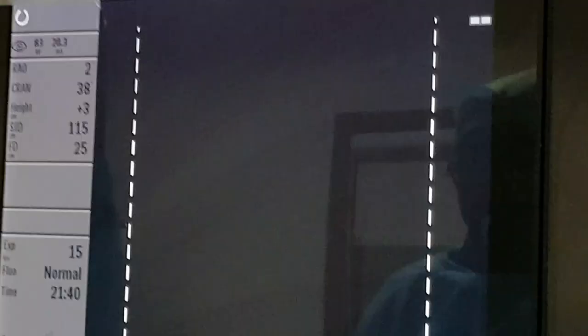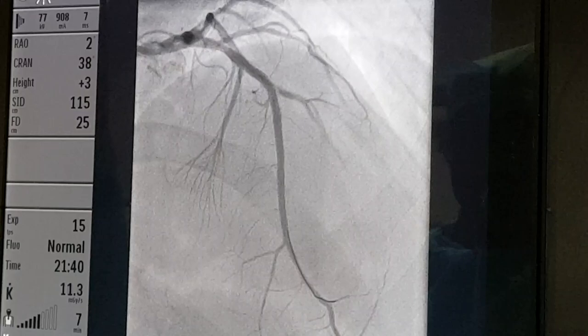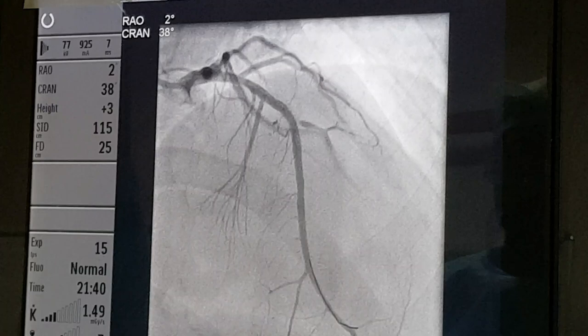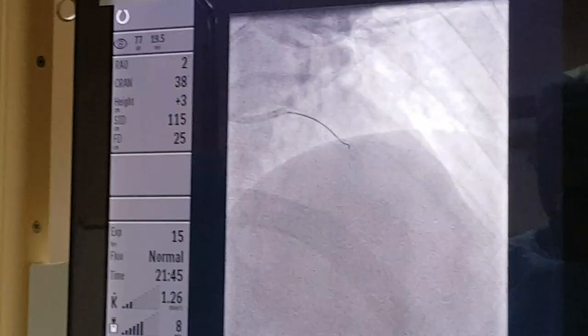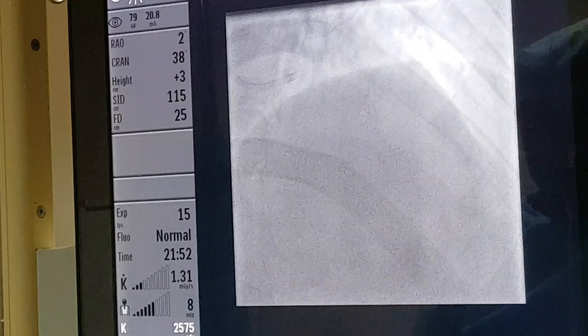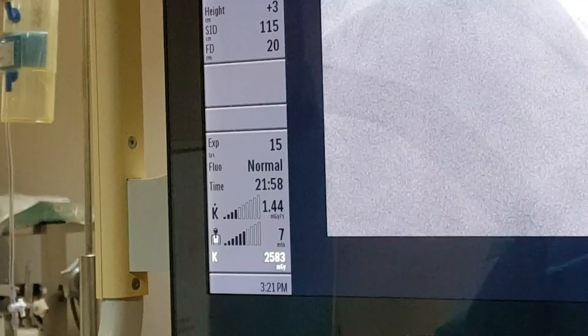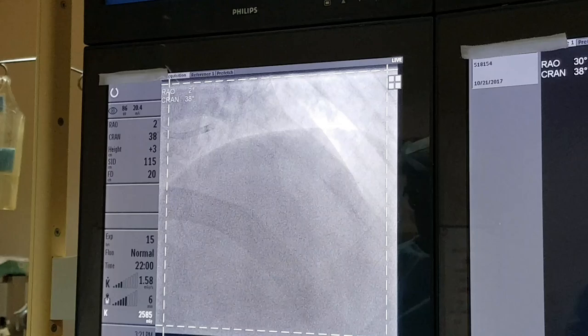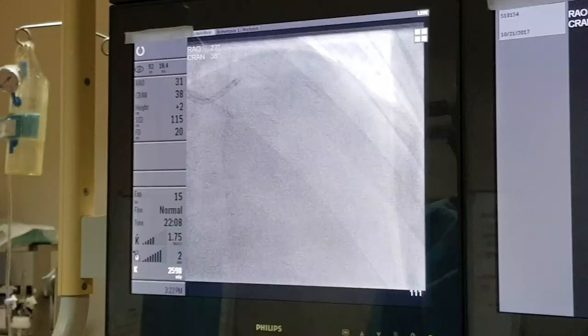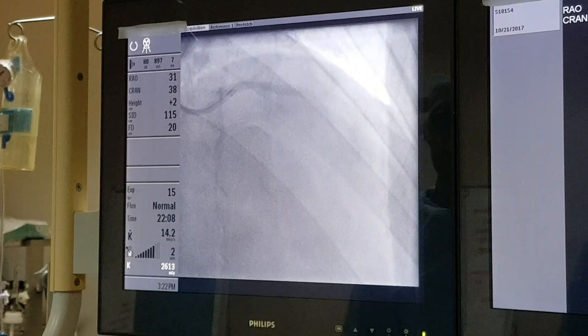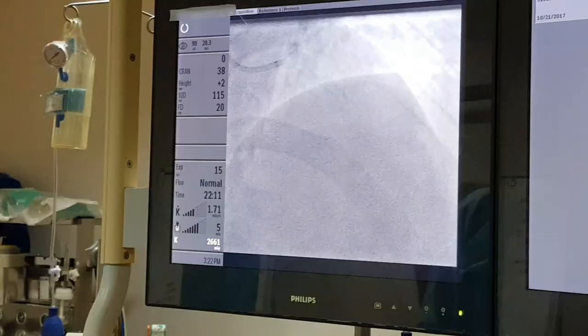I am checking in another angle to see whether there is any perforation or complications — everything looks fine in that view also.